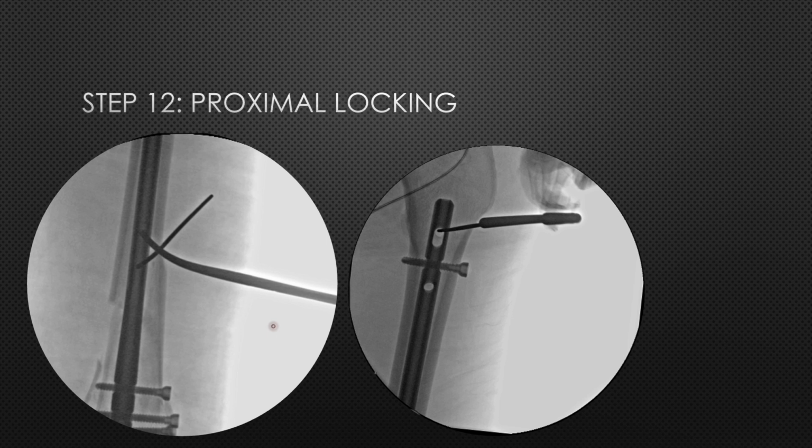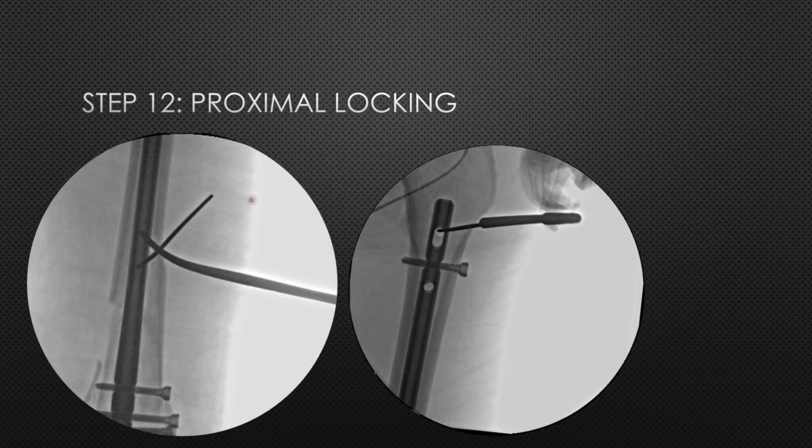Now we have inserted the other screws. So these screws are actually in different planes. 2 screws are medial lateral, while 1 screw is from the anterolateral and directing towards the posteromedial, while this screw is from the anteromedial and directed towards the posterolateral. Now the next step is proximal locking.